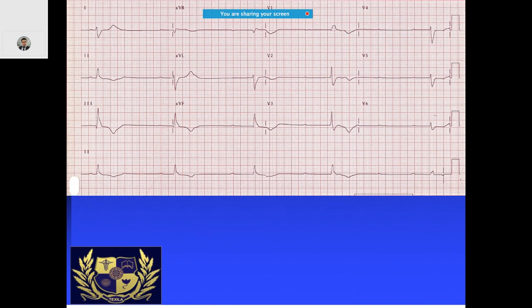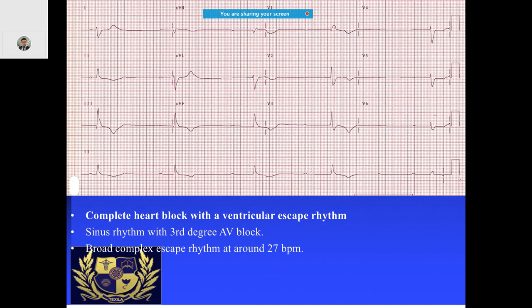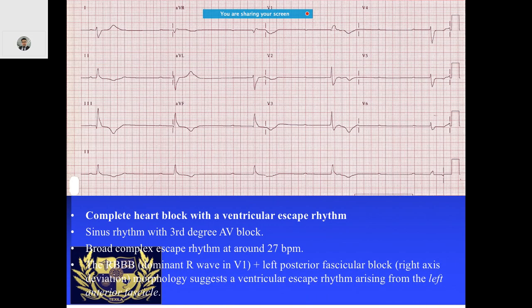In this ECG, there is a QRBBB pattern and right axis deviation. The RR interval is very much fixed, and there is a fixed PP interval as well. This is characteristic of complete heart block with a ventricular escape rhythm — third-degree AV block.